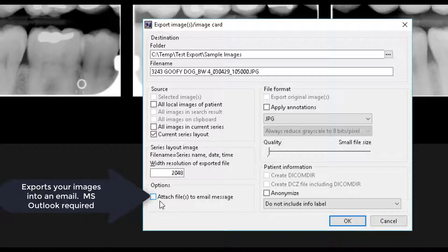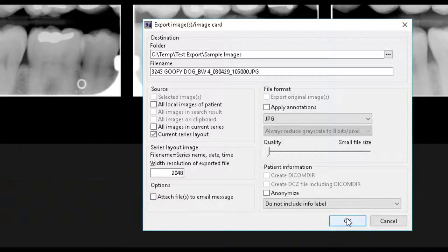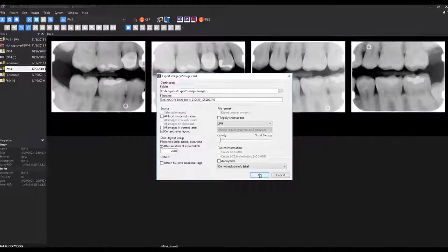After you have made your selections on the Export dialog, select OK to initiate the export.